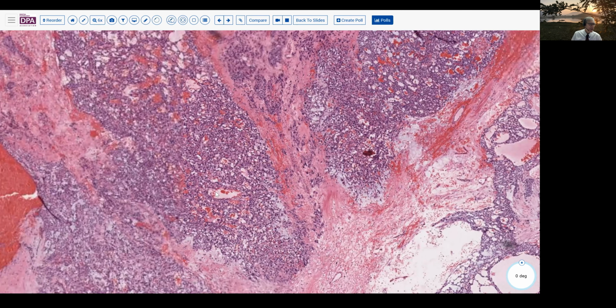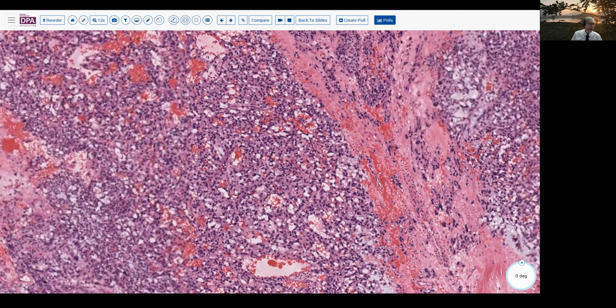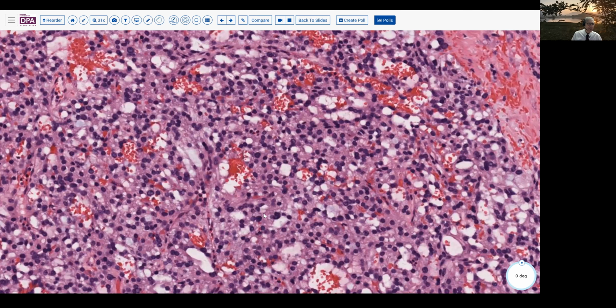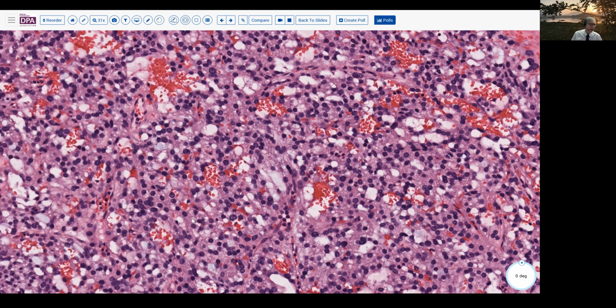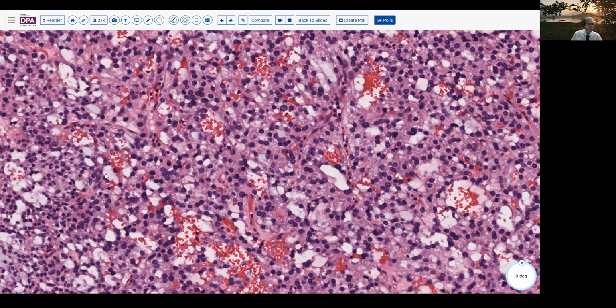So we'll take a look at some of the cytology of this tumor. And again, we see this fairly bland appearance, sort of lightly vacuolated cytoplasm, round nuclei, no grooves, and areas of interstitial hemorrhage. As we saw in the gross, that is replicated here in a lot of hemorrhage associated with these small cystic spaces.